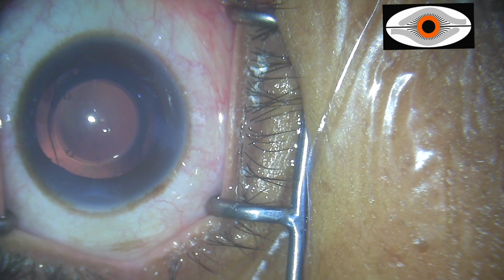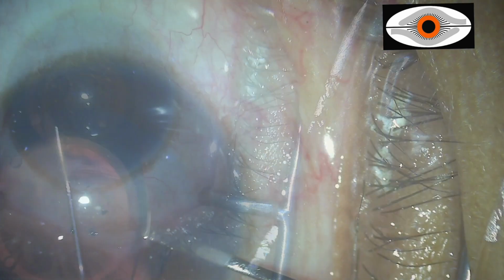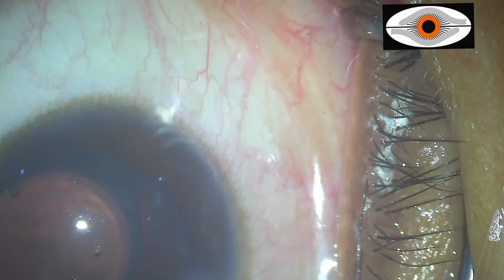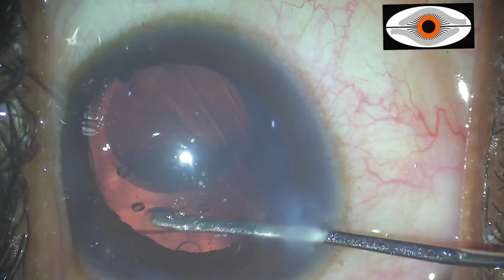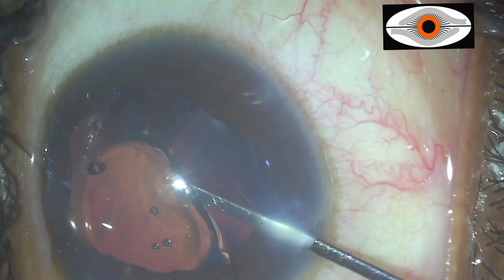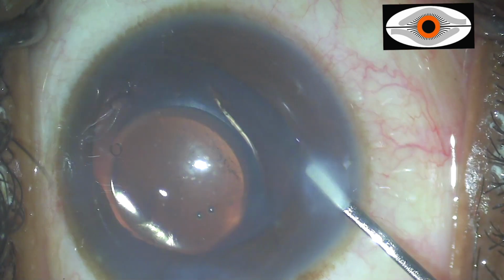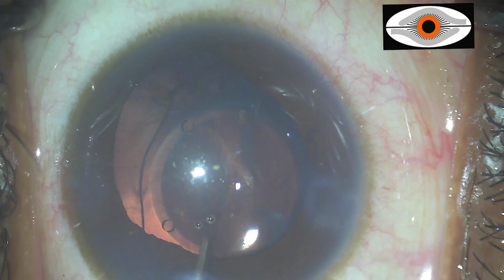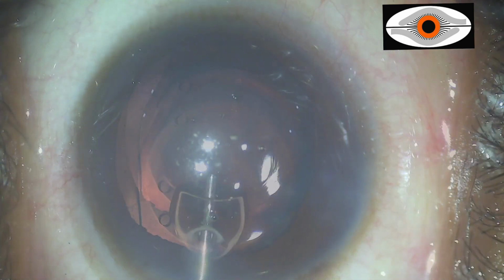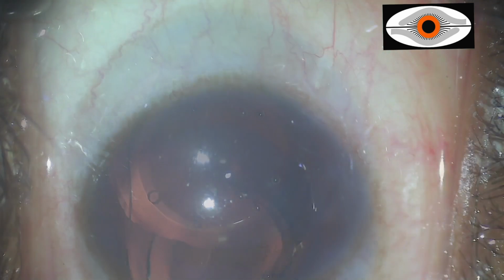First, dispersive viscoelastic is injected into the anterior chamber for endothelial protection. This is followed by untucking all the four haptics of the IPCL from underneath the iris using a spatula. The IPCL is brought into the anterior chamber and explanted out.